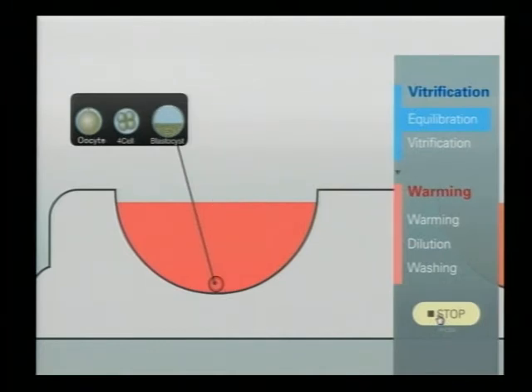The procedure protocol for the vitrification of blastocyst and the four-cell and oocyte is the same. Then the volume, okay, shrinkage begins. You will see the maximum shrinkage at the time of around 90 seconds. So all the blastocyst cavity disappears in this step.